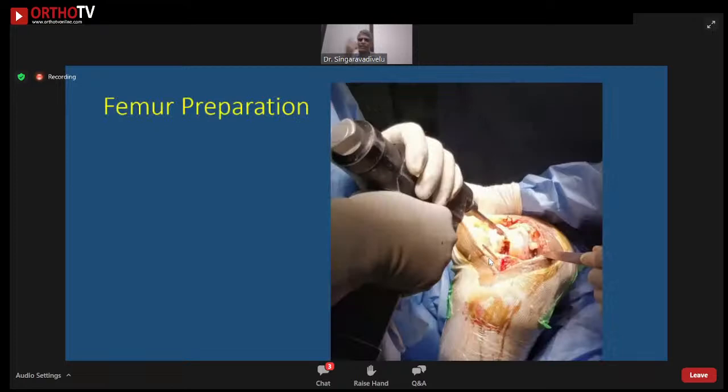For the femur, as Dr. Anin already mentioned, it has to be an intramedullary rod, because the intramedullary rod passes along the medullary canal and that establishes the anatomical axis. We know that we are going to take a 6 degree cut off from the anatomical axis. If you carefully see the X-ray, the center of the medullary canal is not exactly the depression between the medial and lateral condyle. The medial condyle overhangs up to this place. The lateral condyle doesn't stop in the midline either. The medial condyle goes up to the lateral aspect of the intercondylar area.